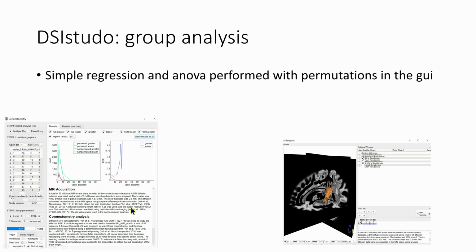And it can give you the significant paths, looking across all the paths of the brain, which ones are actually significant, once testing for permutations and your multiple comparisons. And it gives you a very nice GUI interface for then mapping out these tracts, and you can get the extraction values from those.